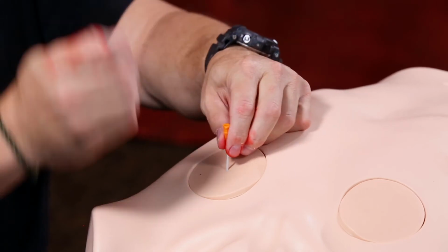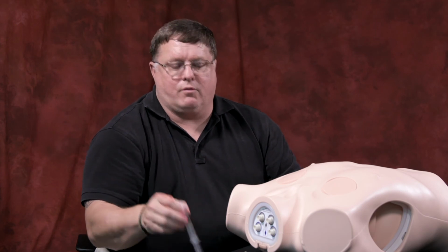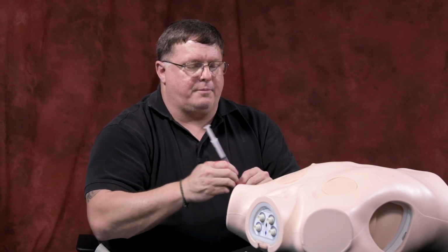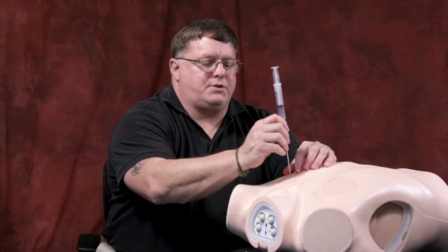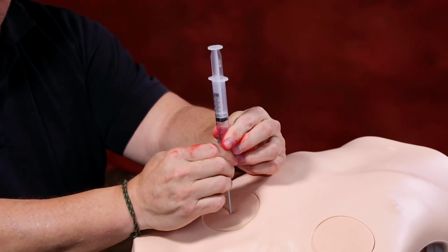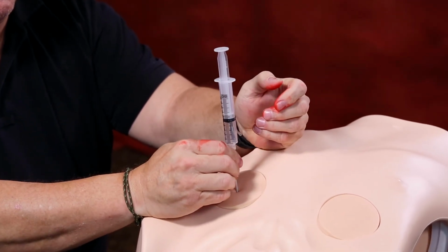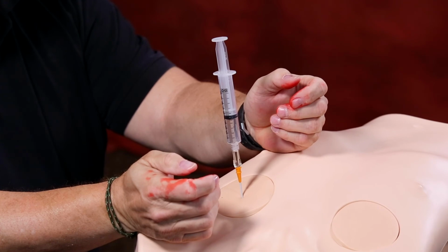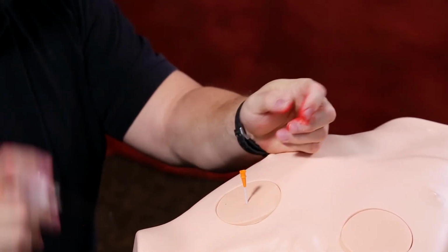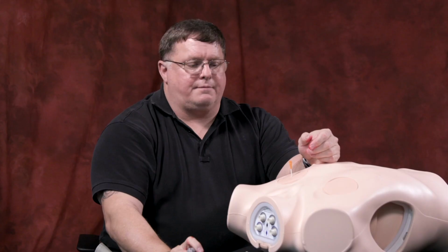An alternative way of doing this is if you're in a noisy area where you feel like you might not hear the rush of air come out, you can take a 10 cc syringe and fill it with about 5 cc's of water, attach it to the bottom of your needle, and as you go through and enter the pleural cavity, watch for bubbles in the barrel of your syringe. And again, the same thing applies. Once you see bubbles, the syringe comes off, the needle comes out, and you leave your catheter in place to let the air drain off.